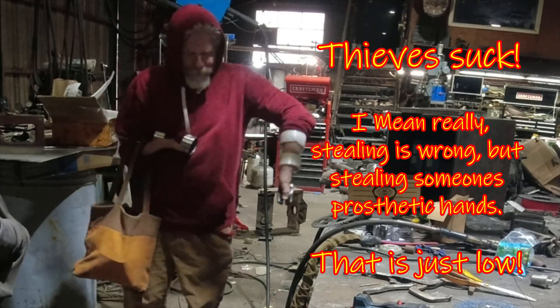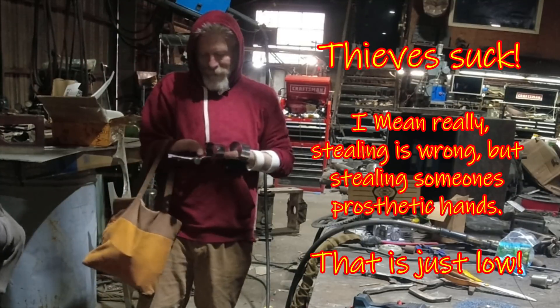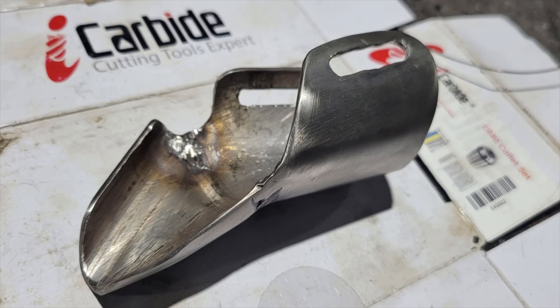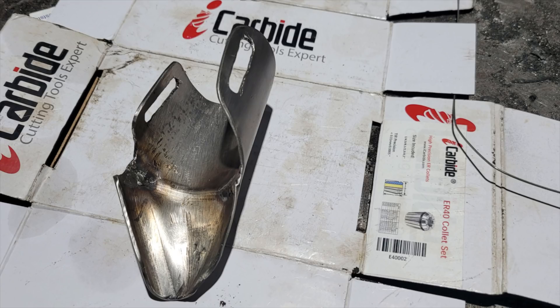Unfortunately, his bag came up missing, so now he is in need of a new set of prosthetic devices. The first piece that he wanted to reproduce was the pen holder. The awesome thing about this being a replacement piece is that since he had so much time using the original prosthetic, it gave him a pile of insight as to what could be done to improve its function.